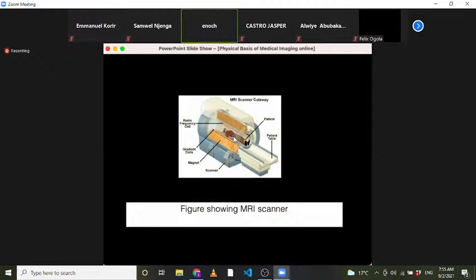When they are precessing under the influence of the RF field, they are pointing in the same direction, so we say they are in phase. When it is removed, they start to dephase, they interact with each other and lose energy between themselves. So for T2, we sometimes say it is spin-spin interaction. When we measure that, it results in formation of a T2 signal.